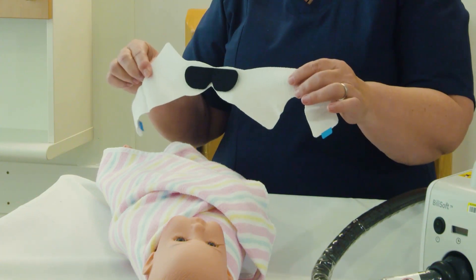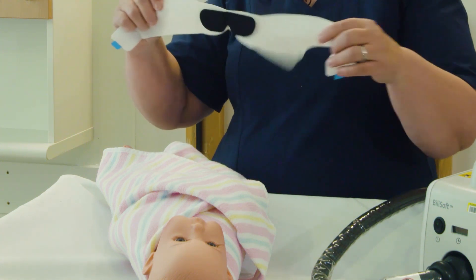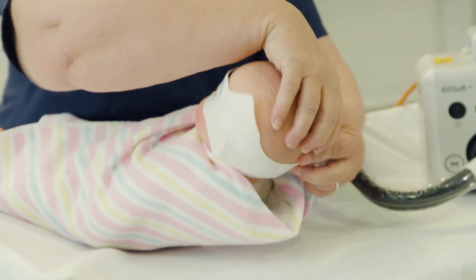The manufacturers have also recommended that the baby wear eye protectors. The black side should be against the baby. It is a stretching material with a velcro strap. This does not hurt your infant — it simply protects from the light.